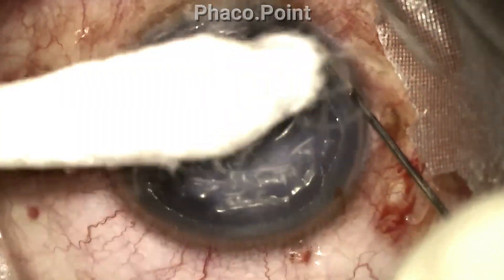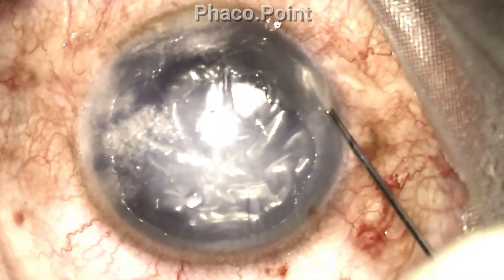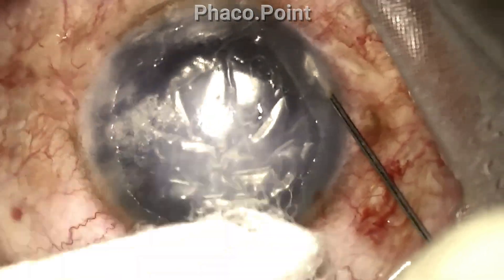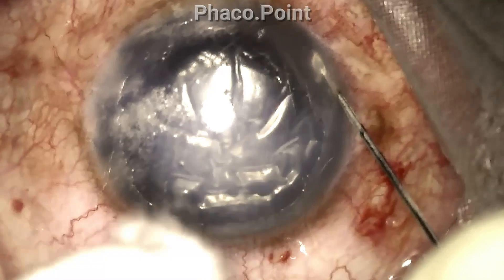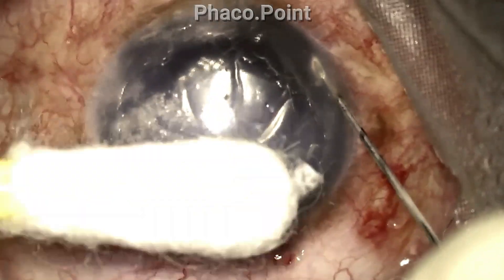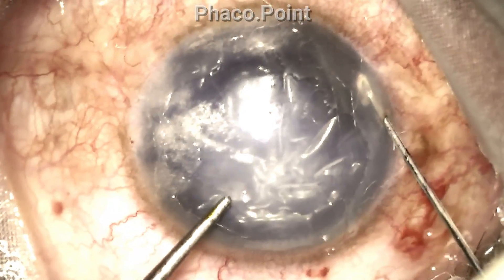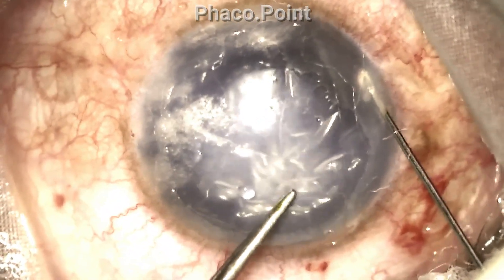This step of letting the fluid come out of the venting incisions often takes a couple of minutes. You need to continue doing this until no more fluid comes out from the venting incisions — that is when you know that all the fluid is probably drained out. I still have my needle within the anterior chamber and as the fluid keeps coming out, I keep intermittently injecting a little more gas to encourage the fluid to come out even more.